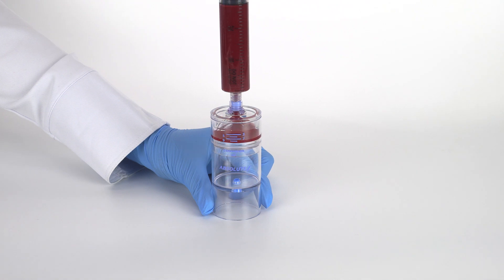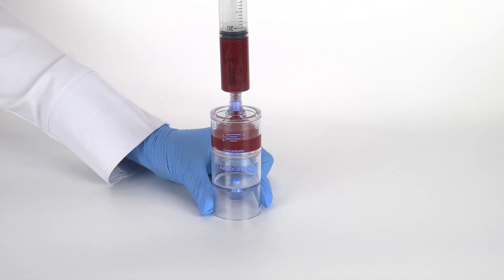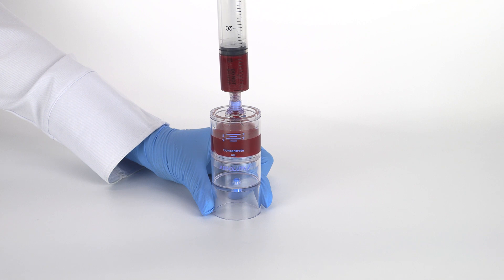Attach the 30-milliliter blood syringe to the needleless port and slowly inject the anticoagulated blood into the device.